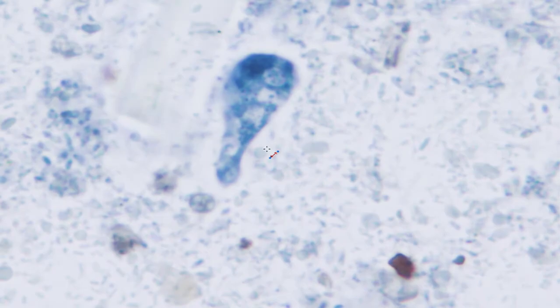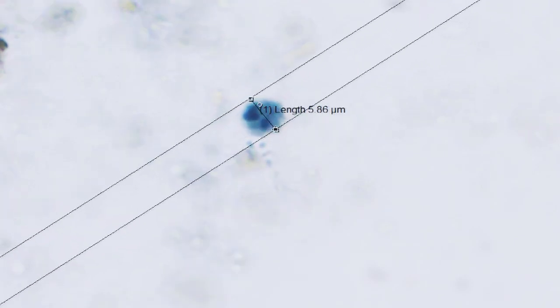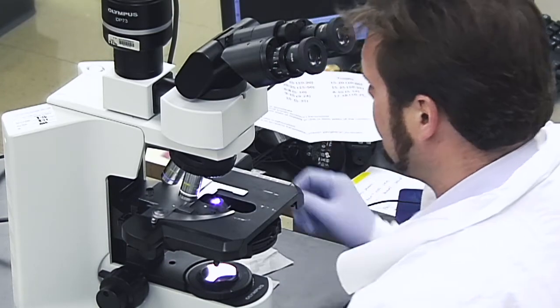Here's a lovely Iodamoeba buetschlii trophozoite sending out pseudopodia. And here's another cyst of Entamoeba hartmanni, very small, measuring only about 6 micrometers, but with, once again, those quite rounded chromatoid bodies that are so distinctive of hartmanni. Not the greatest stain, that one, unfortunately, but hopefully it gave you some idea of some of the things you might see in real practice.